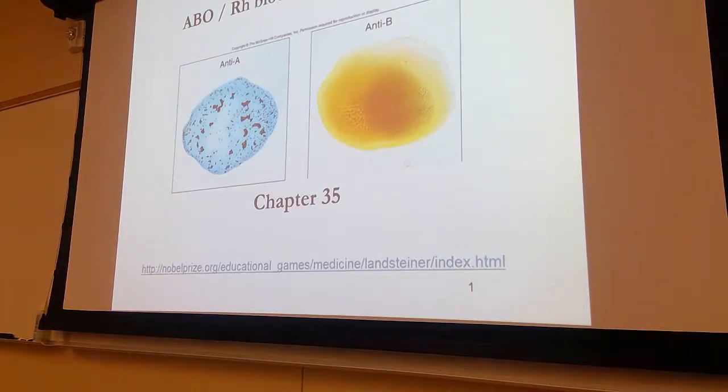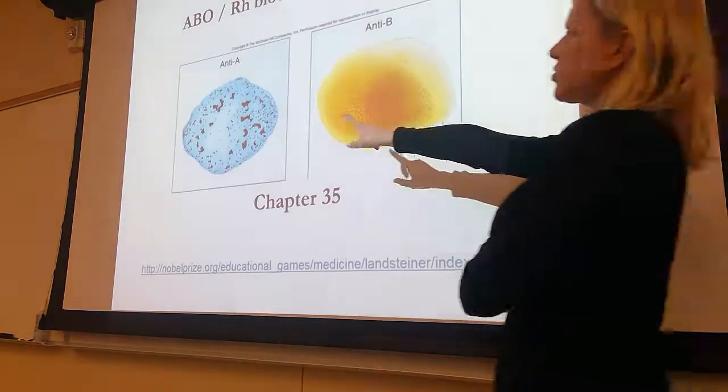Blood typing is an immune reaction. That is what we are manipulating. And up on the screen, you are seeing an immune response in the left picture. Can you see the clumpiness? Can you see the blue picture and all the clumps there? That is an immune reaction.